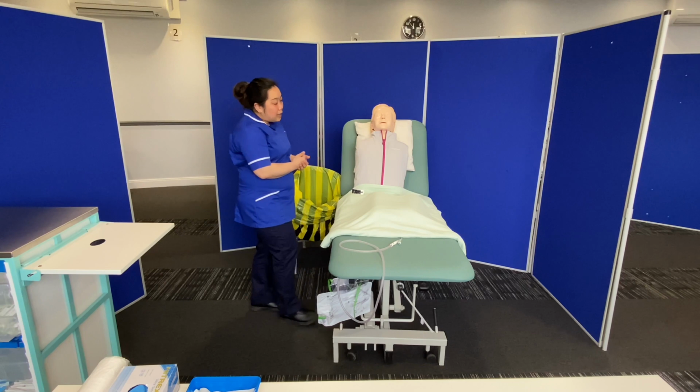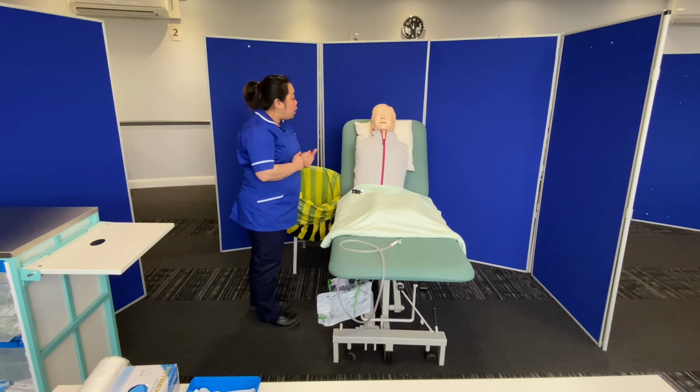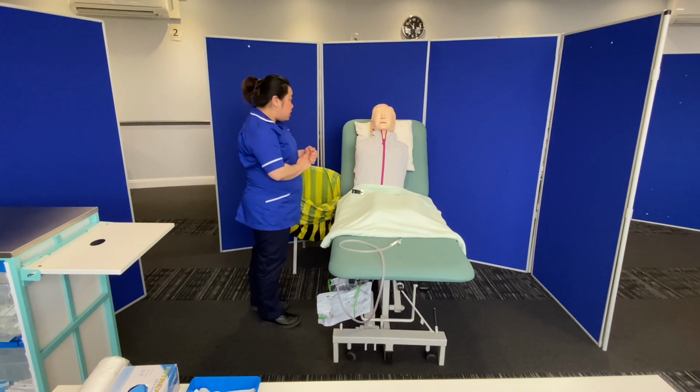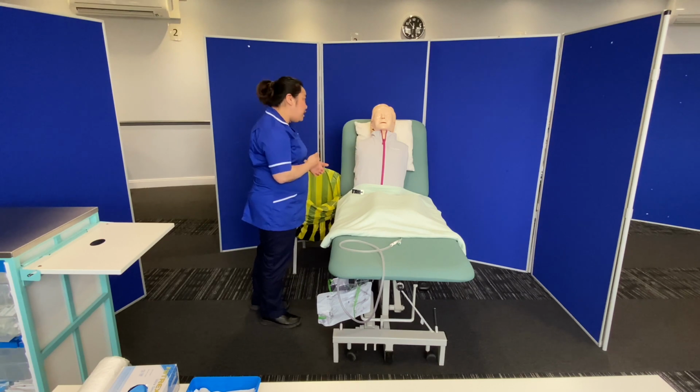So I can see you've got a catheter there, Lindsay. So I was saying earlier, we're gonna collect a sample of your urine. So this will entail us to collect your urine sample via a syringe through your catheter tubing. You shouldn't feel any pain or discomfort, but if you may feel any of these, you can let us know so that we can stop the procedure immediately. Does that sound good to you?